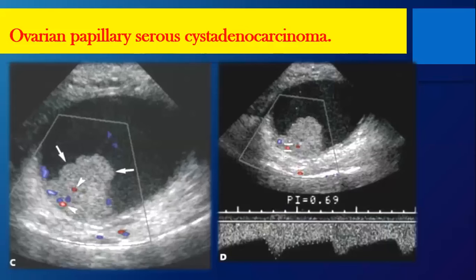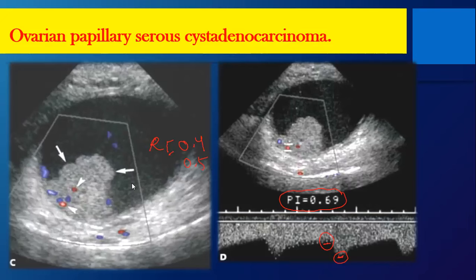Here we have a lesion with a soft tissue part. By the Doppler, we have the wave — look at the diastole and the systole. The difference is slight, so the diastole is close to the systole. This is more towards malignancy. By numbers, the resistive index is less than 0.4 to 0.5, and the PI is less than 1 — these are the incriminating numbers suggesting malignancy. We can suggest this by the Doppler, looking at the numbers and the shape of the wave.